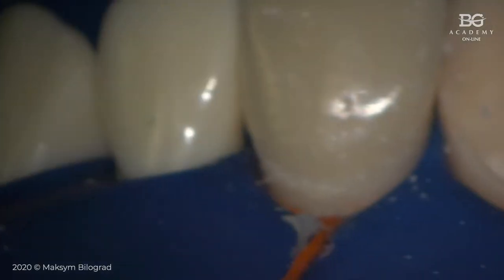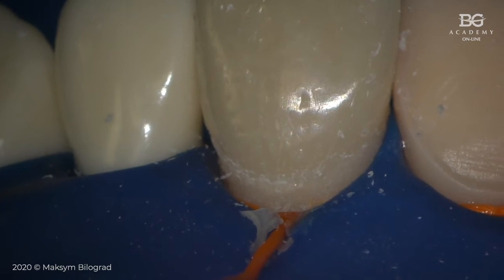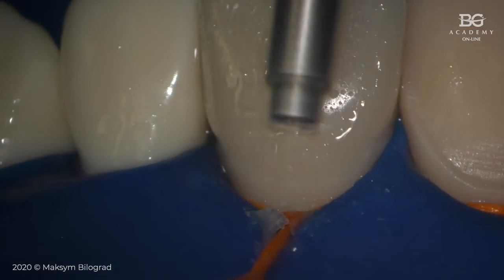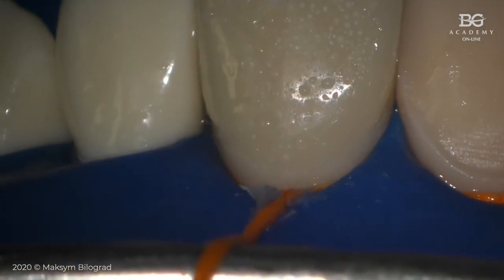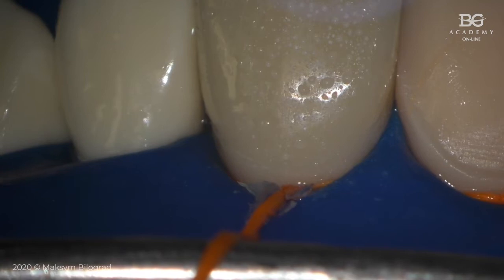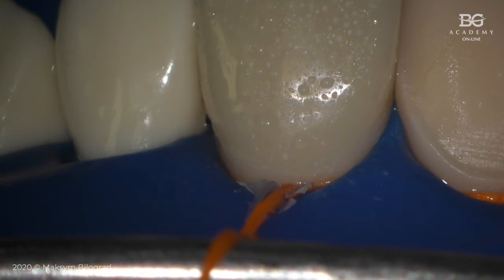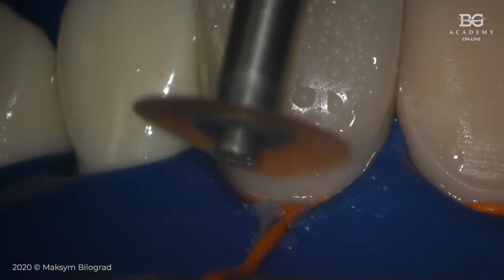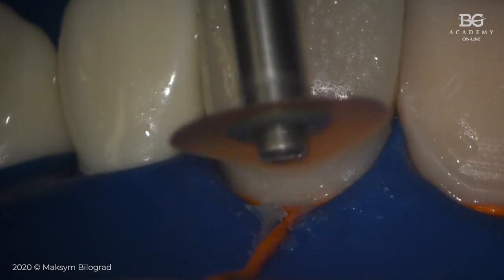I will just take a really small size of orange softflex disc, 5,000 RPM only, just 5,000 RPM, and we will go for polishing of this area with a small size of disc. My mandrel is not a new one, that's why it happens that the disc flies away. Disc is flying away. Okay, so yeah, take another one and just polish this transition.